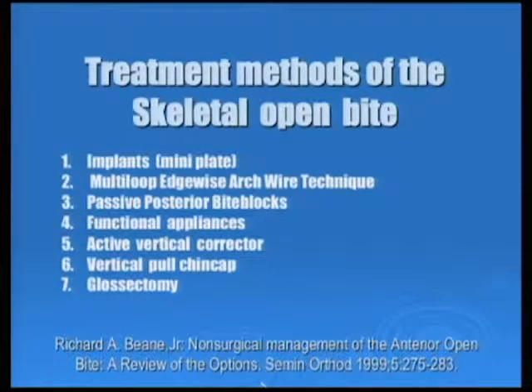The first treatment method Dr. Bean recommended is mini implant. He did not mention mini screws because this paper was introduced more than 10 years ago. Today, I'm happy to show you that the mini screw implant can function as well as the mini plate.